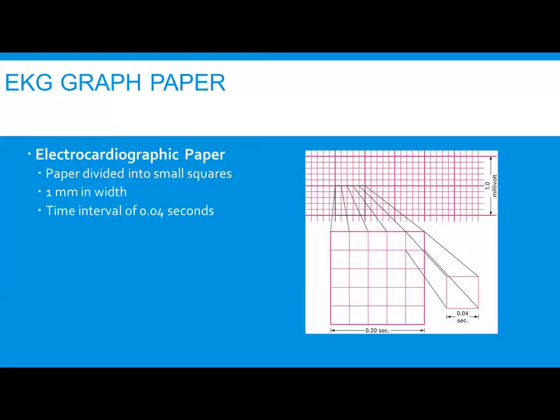We're going to be looking at the small boxes to count because we're going to need to know how long they are. To put it in perspective, the longer a contraction is on the paper means the longer that it has taken for the heart to contract. Okay? That's why we need to know that. And we're going to have baseline numbers. We're going to have normal numbers here in just a few minutes. Okay?